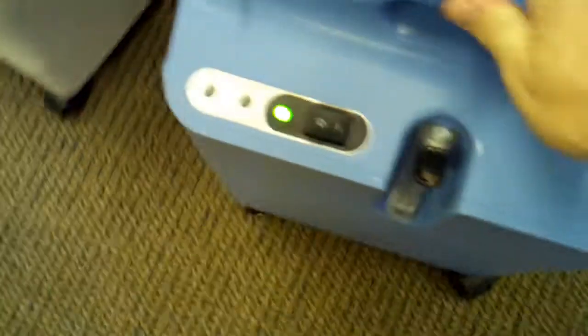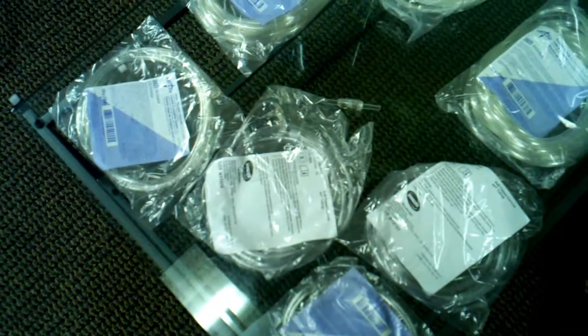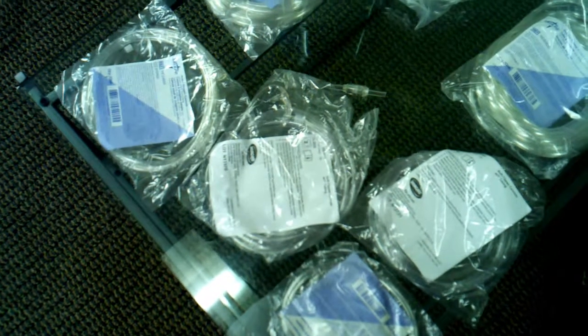When you order the concentrator from us, you will see that we also include the cannulas. I don't know if a lot of our competitors are doing it, but we think it's very important because you can't administer oxygen without a way to get it into your body. This is how you use these cannulas — it comes in different sizes and different lengths. Some people like different nose cannulas, some people like masks. We ship anywhere from four foot, and we have the seven foot from Invacare, which is a very soft-tipped cannula. We have the standard cannula itself, so you can order tubing by itself.